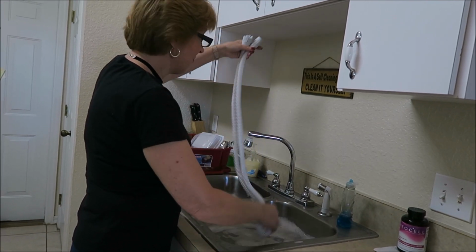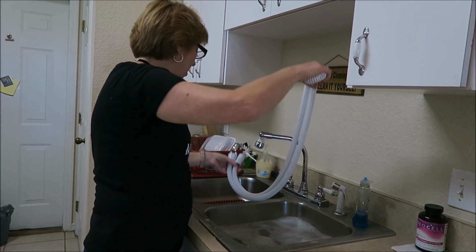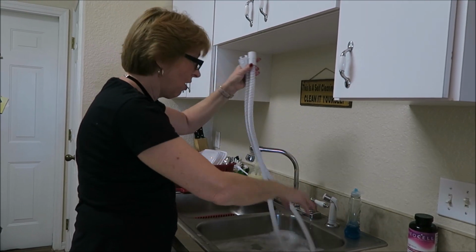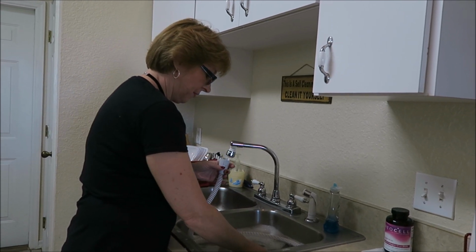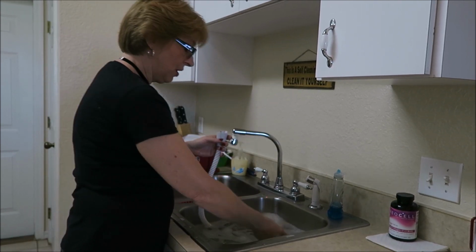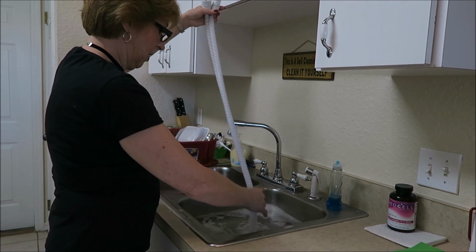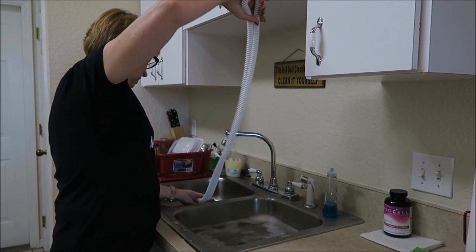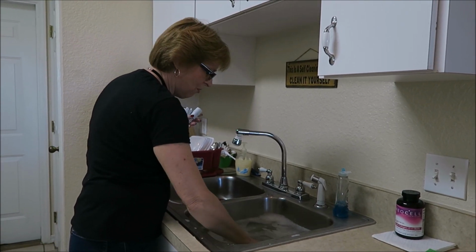Again, like I said, this is very time consuming. But for me, I don't care if it takes me an hour to get this thing cleaned properly. I don't want infections. I have enough going on. I don't need to add to it. My body does not respond well to antibiotics, prescription antibiotics, that is. All right, I've done that 3 times. I'm going to drain my water.